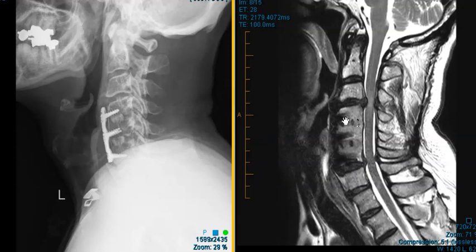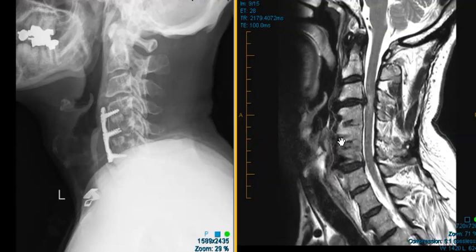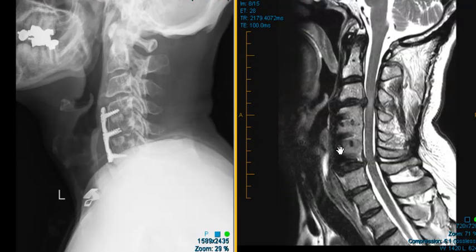On the MRI here, you can see how different this looks. The metal, instead of being white on x-ray, is dark here in the front. We see these linear bands — these are the screws. We see this fusion block.